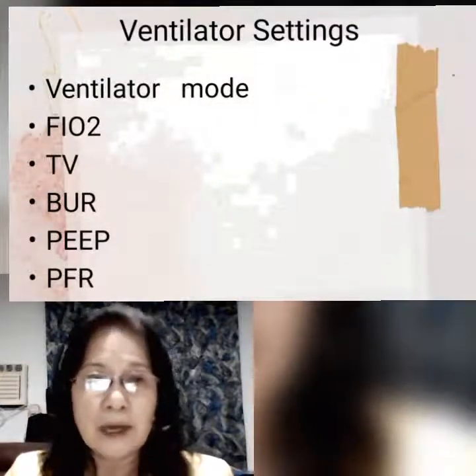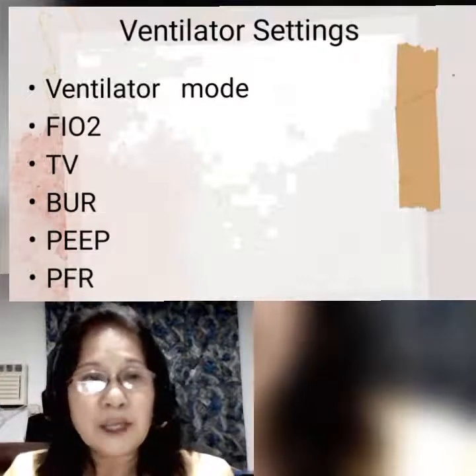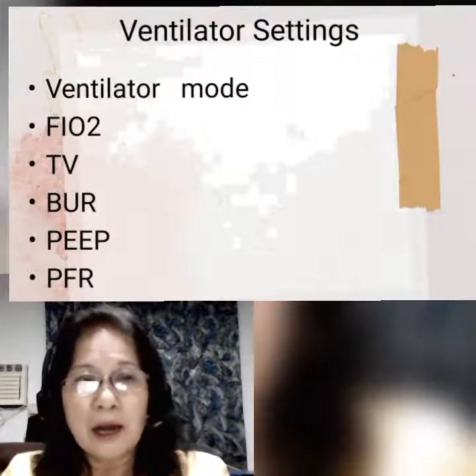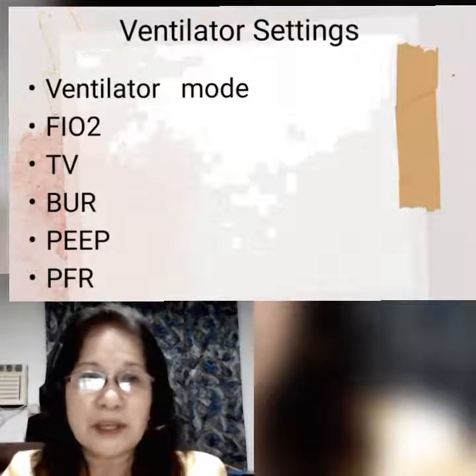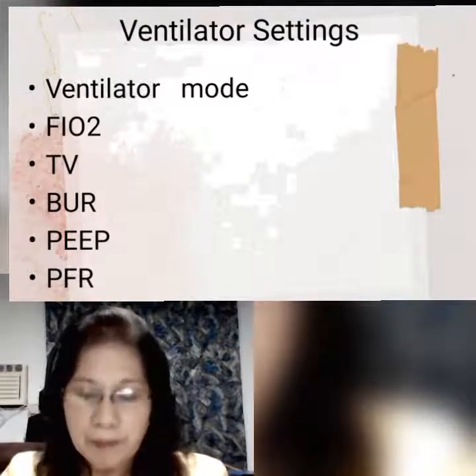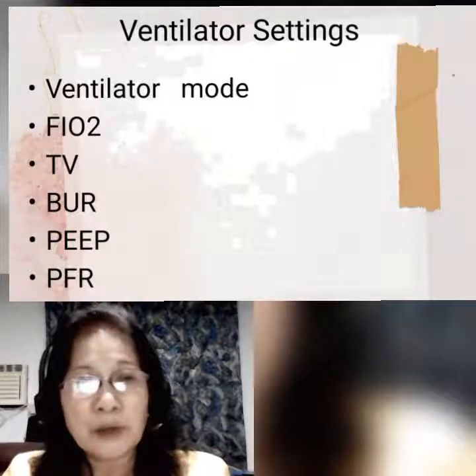Now, we also have ventilator settings. In the ICU, we are responsible for the ventilator settings that the patients will have. So we have to check the doctor's order.